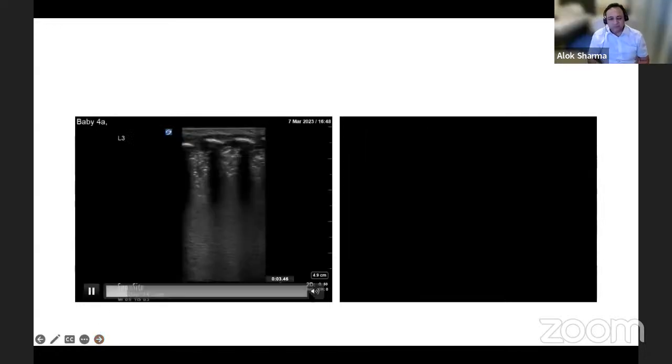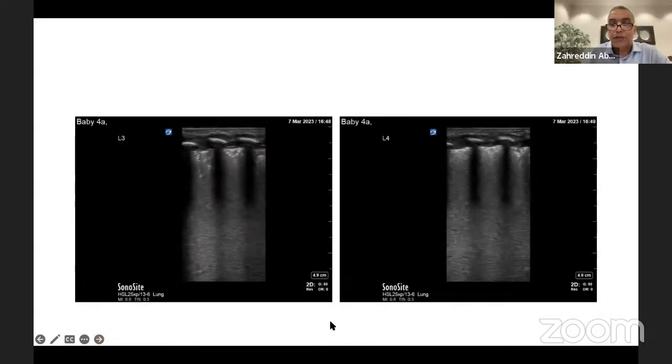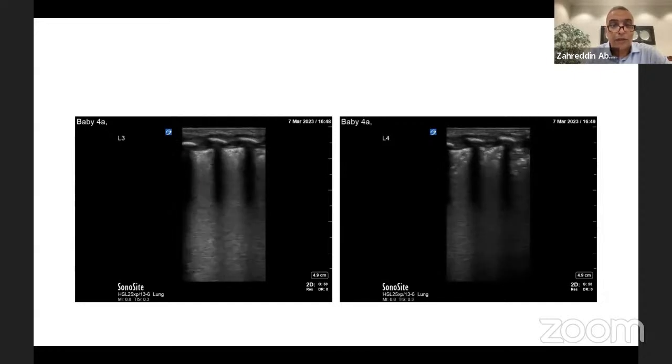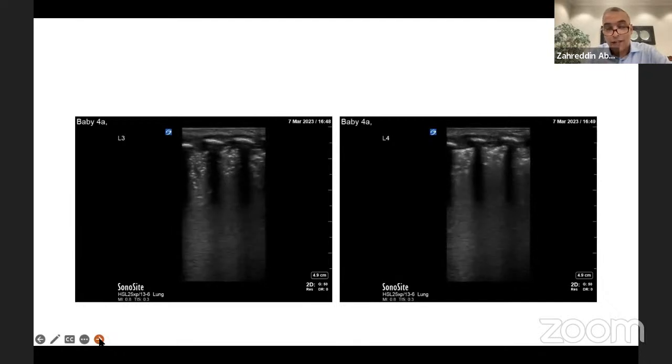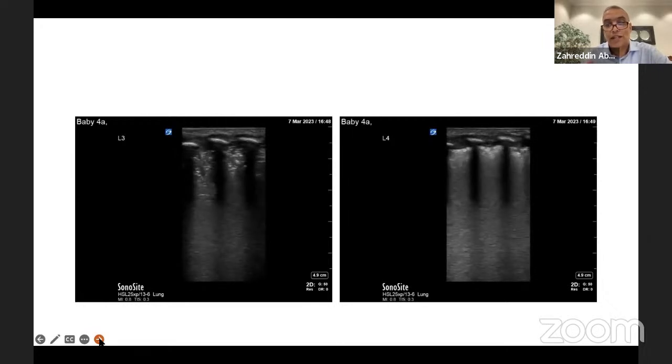So I'll just show you the left lateral views. Again, they are showing the same findings of pleural sliding with subpleural consolidation, or even deeper consolidation with a predominantly B profile on the picture, both on the upper and lower left lateral views. Clinically, my reflection on these scans is that I was pleased, because I could say confidently that there wasn't a pneumothorax explaining the pretty sudden deterioration in this baby. So I was to some extent confident, and pleased with myself for excluding that.